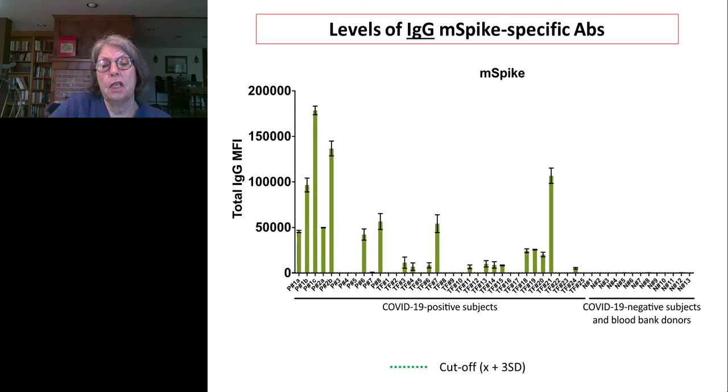although I have to stress that most of these specimens come from individuals who are donors to the program at Mount Sinai to provide convalescent plasma for use as treatment. The titers of their antibodies are tested, and then if they have good antibody levels, they are selected for plasma donors for convalescent serum.